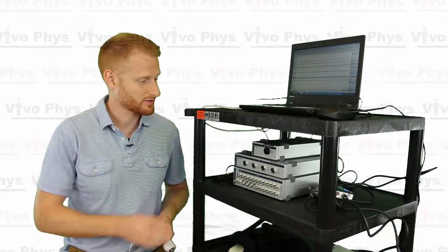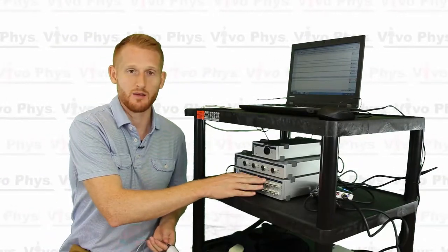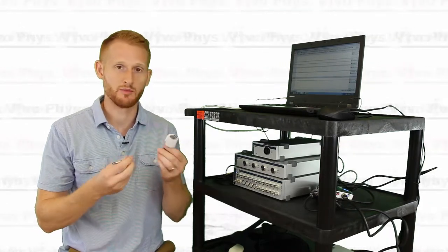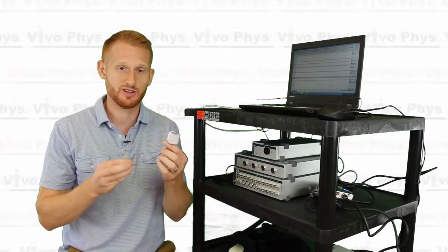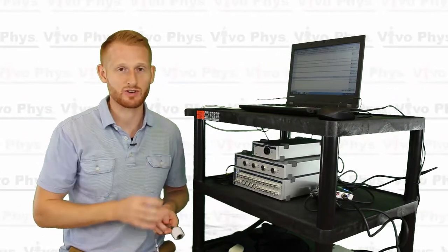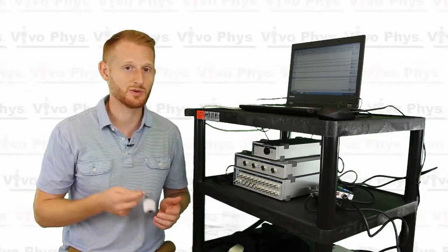Hi, I'm Dr. Evan Matthews. I'm here at Montclair State University in the exercise science lab to show you how to use a PowerLab hardware setup, also using the finger cuff blood pressure continuous blood pressure setup, also from ADInstruments, and the LabChart software to collect continuous blood pressure data.